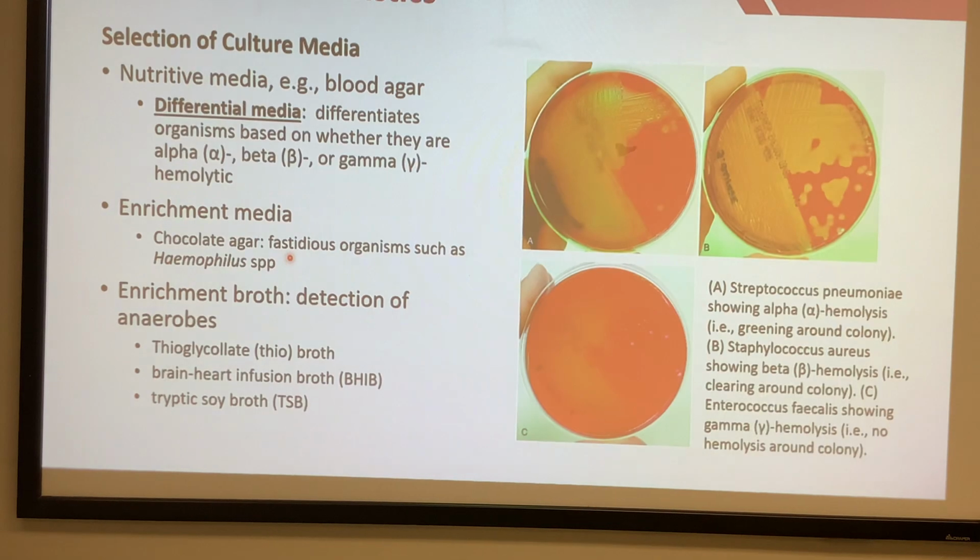Okay, so culture. Here I list all these agars, but I do want to bring it to your mind: we have so many different culture media in the lab. Depending on what organisms you're handling, we use different culture systems. But most often seen and presented are the blood agar media, because we begin with the sheep blood agar. This provides nutrition to support almost everything to grow. These are called nutritive media, like sheep blood agar or bovine blood agar. Sheep blood agar can also serve as differential media.